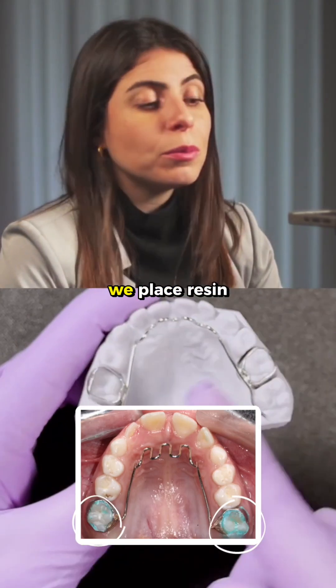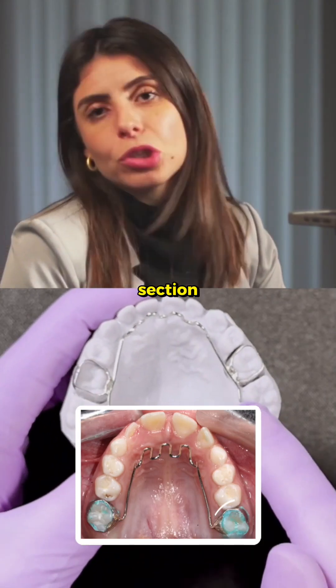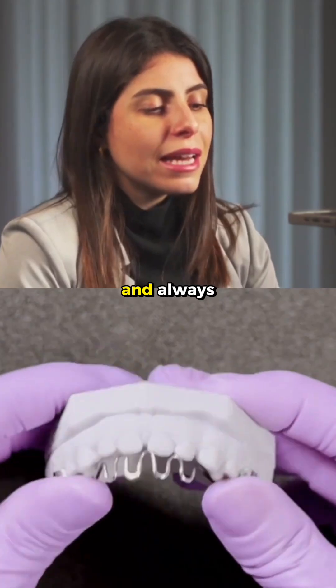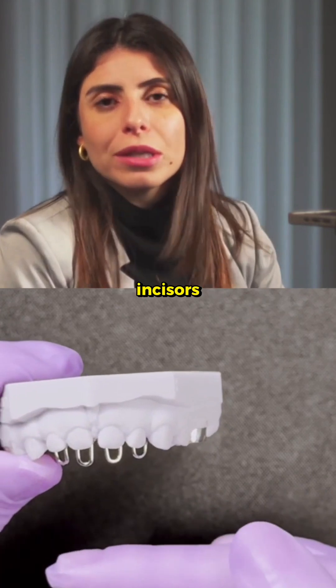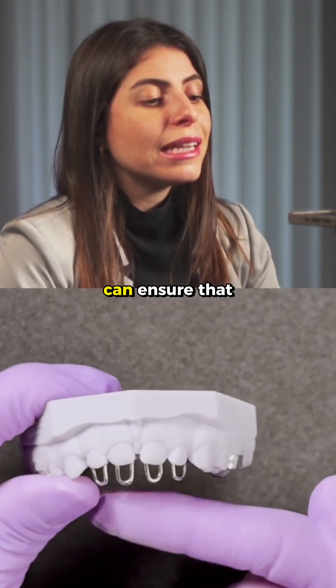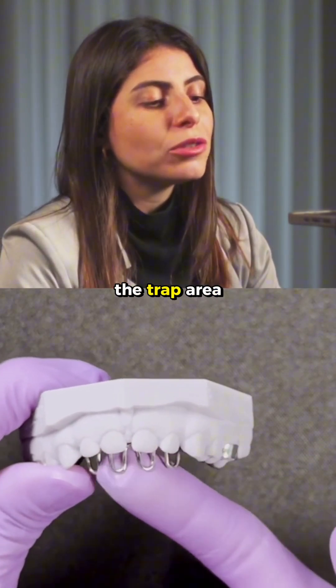Notice that in the clinical part, we place resin on the posterior section to increase stability. And always, it's very important that this trap extends just a little past the middle of the lower incisors. This way, I can ensure that the tongue won't go past the trap area.